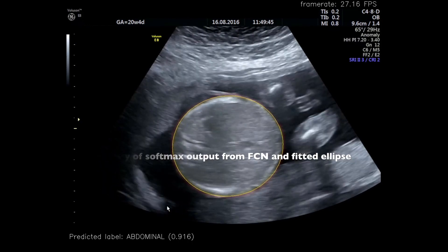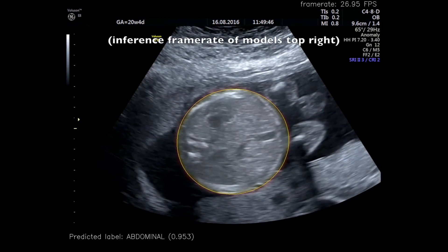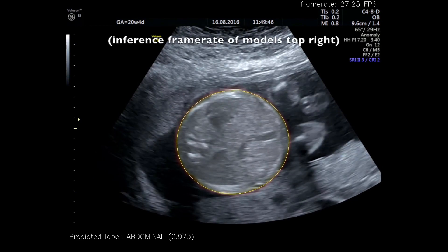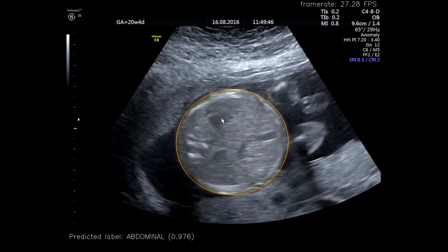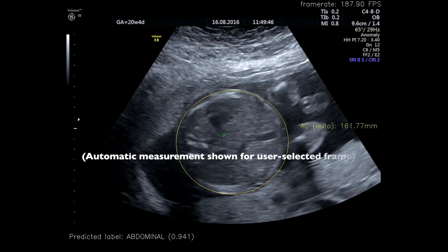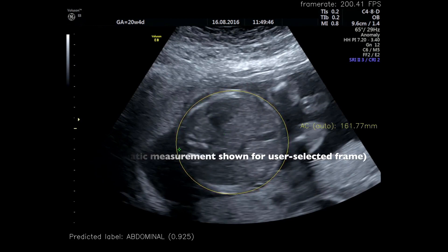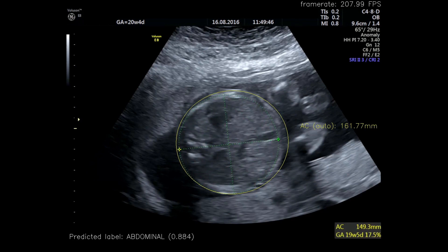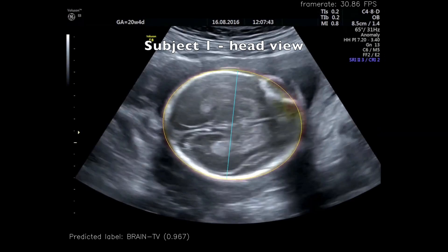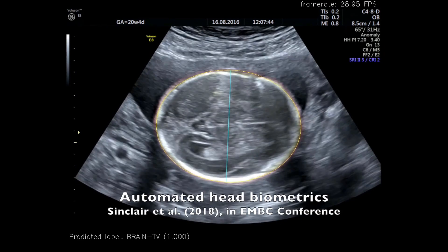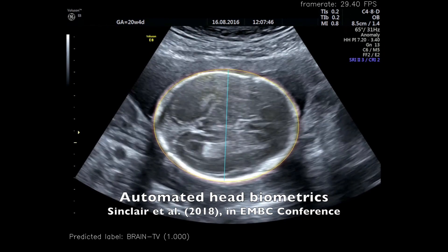What we can see here is a real-time automated annotation of the abdominal circumference from these 2D scan plane images. Similarly, we have an algorithm that is able to annotate the head both in terms of measuring its circumference as well as the diameter of the head, which are key biometrics used by sonographers to assess a fetus.